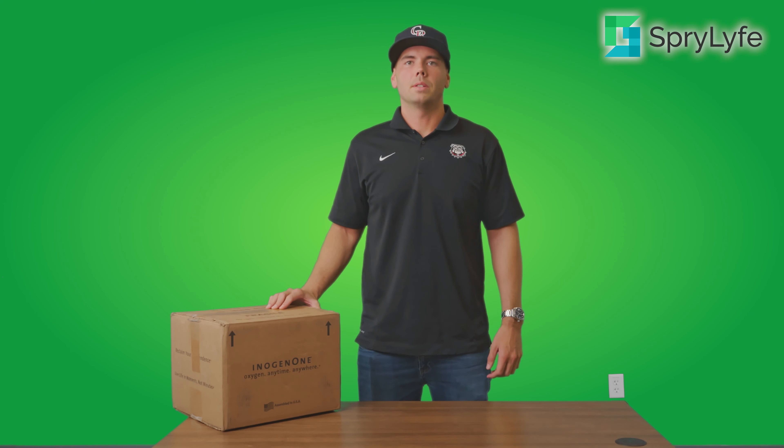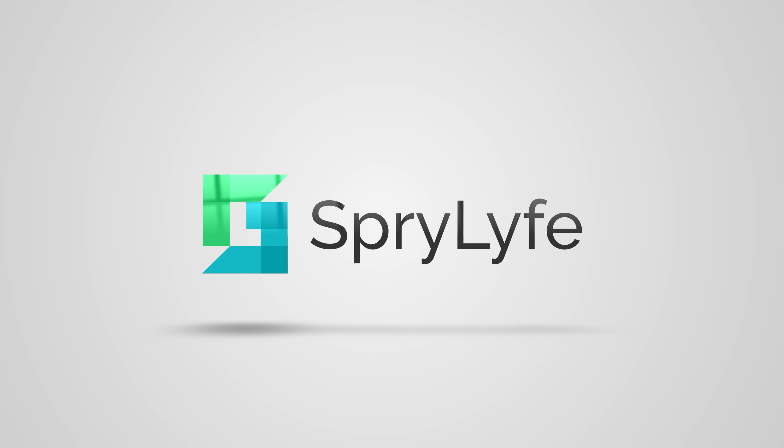Hi, it's Andy with Sprylife Medical, and today we're going to be doing an unboxing of the Inogen 1 G4. So first off, we're going to open up this Inogen 1 G4 box and show you everything that comes inside.